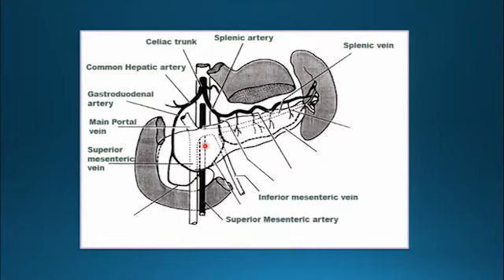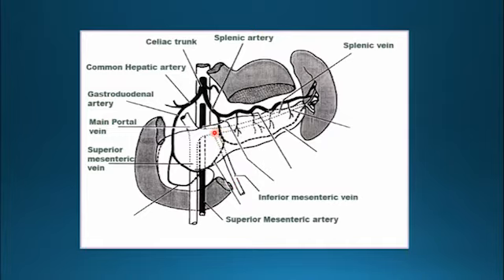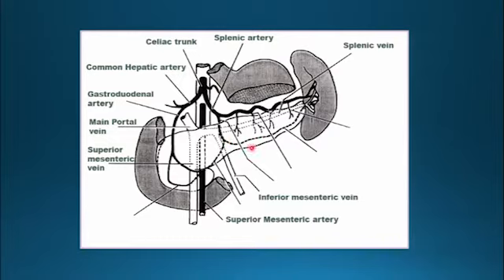Here you have the abdominal aorta, and your first branch is your celiac trunk, which bifurcates into the common hepatic artery and the splenic artery. The splenic artery courses lateral toward the hilum of the spleen. The splenic vein originates at the hilum, courses posterior to the pancreatic tail and body, joins the inferior mesenteric vein, and then courses medial to join the superior mesenteric vein, forming a confluence. You'll use these vascular structures as landmarks to find the pancreatic tail, body, and head.